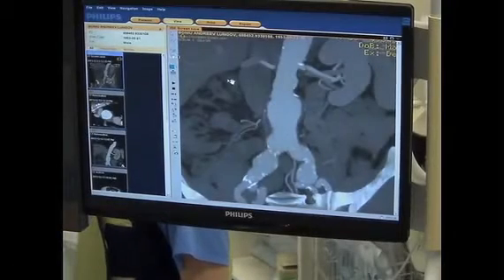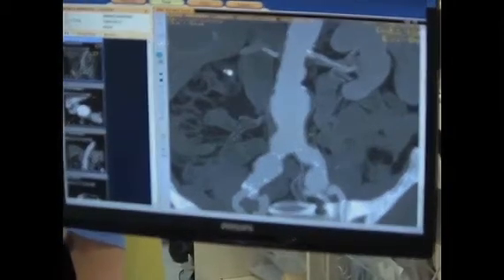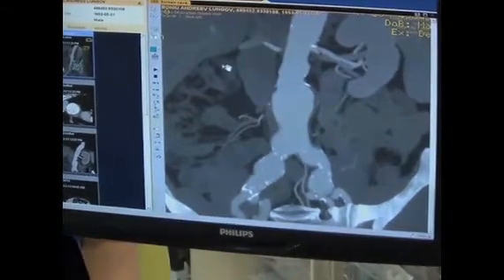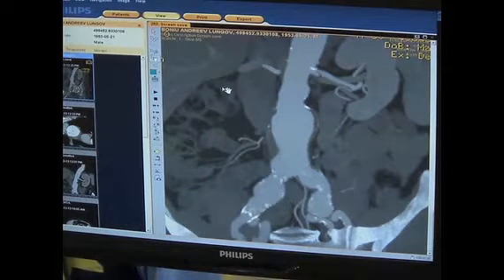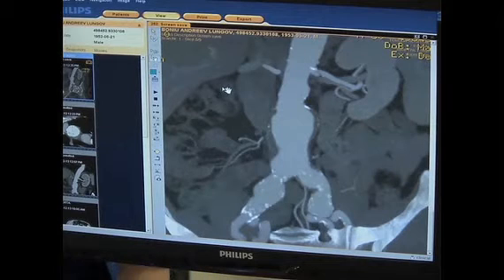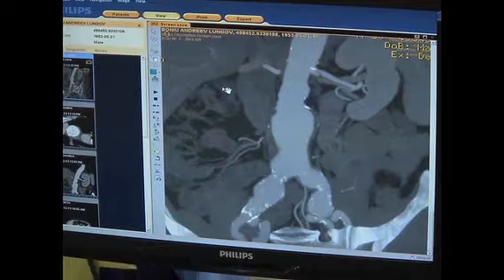In fact, the patient is a 61-year-old man after aortic valve replacement with mechanical valve and ascending aorta dilatation, still not aneurysm, but he had during the follow-up period this abdominal aneurysm, and because the aneurysm is symptomatic and there is an increase in diameter, we decided to cover with stent graft.